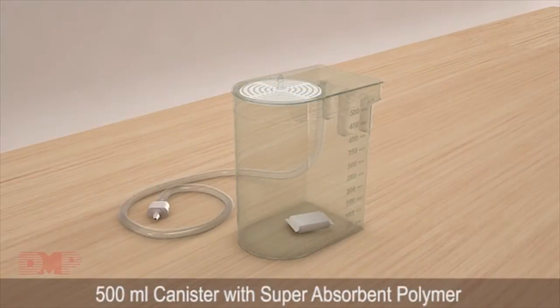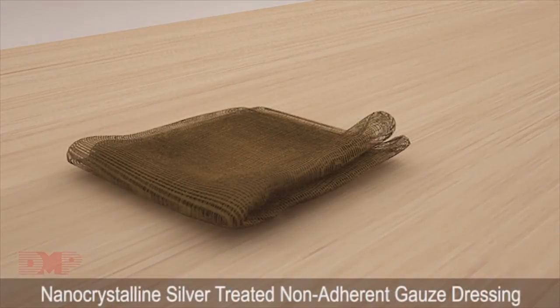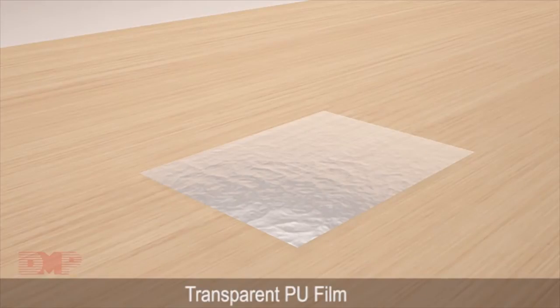500ml Canister with Super Absorbent Polymer, Nanocrystalline Silver Treated Non-Adherent Smart Gauze, Nanocrystalline Silver Treated Non-Adherent Gauze Dressing, Umbrella Shaped Track Pad with Connecting Tube, and a Transparent PU Film.